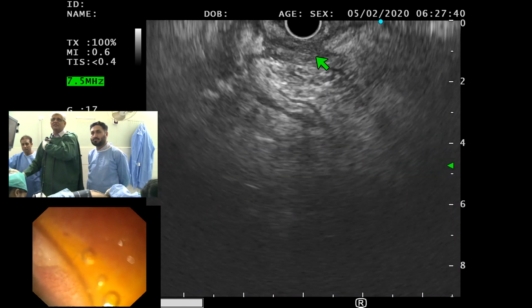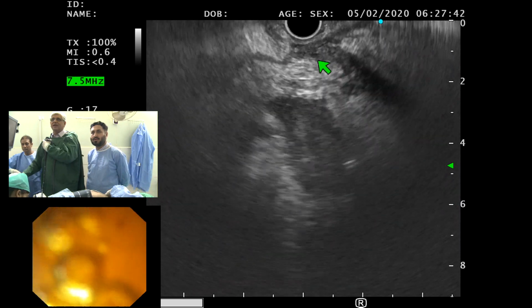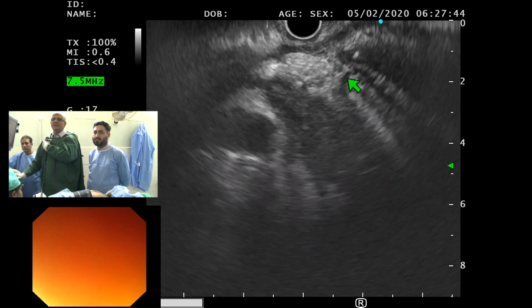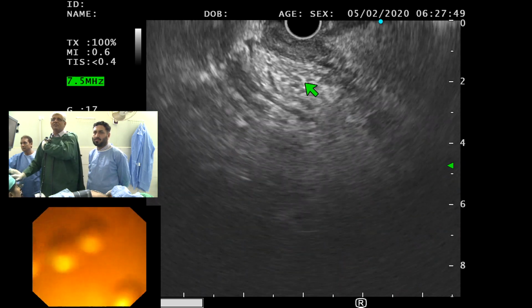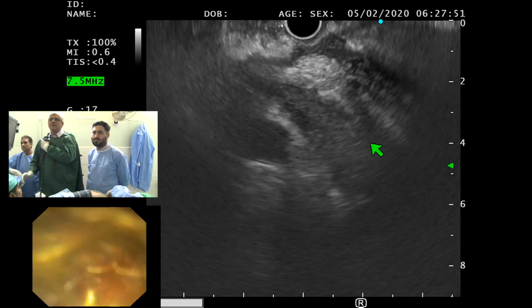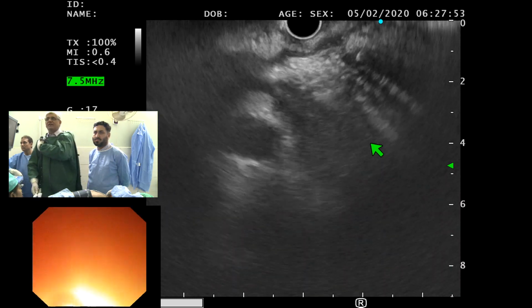So we've looked at the uncinate here. We've looked at the bile duct with the stent in it. We've seen the pancreatic duct going. There is no pancreas divisum here. You can see the pancreatic duct going that way. I only saw one area in that.